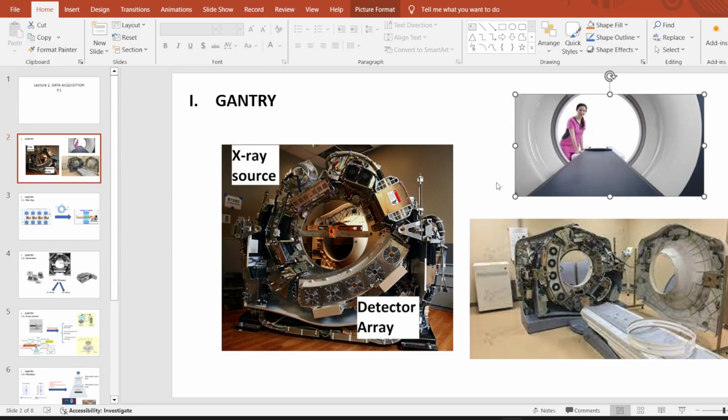The second most important thing, maybe the famous buzzword when you talk about the gantry, is the size, my friend. The bore size. Everybody talks about bore size. Even in MRI, they take care about bore size. I think you have all heard about the bore, right?